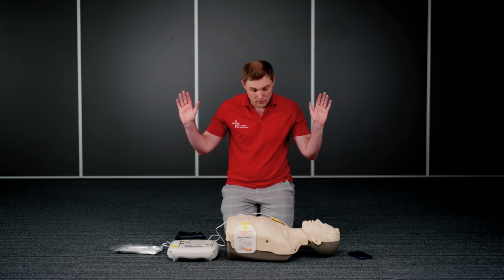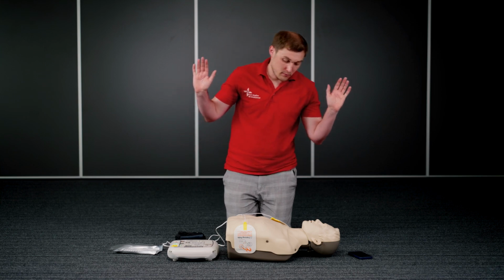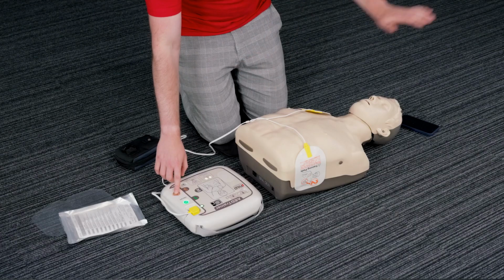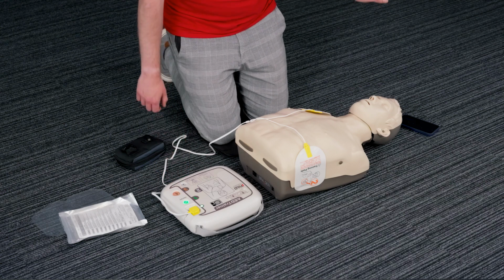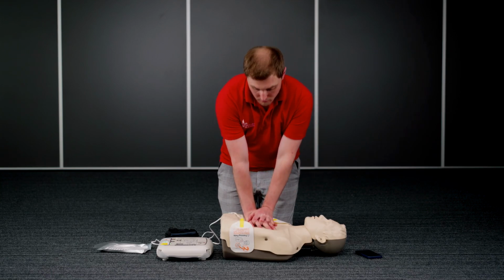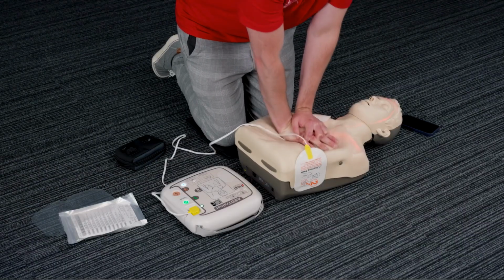Analysing heart rhythm. Shock advised. Stand clear. Press the flashing orange button now. Shock delivered. Begin CPR now. Press the flashing blue I button for CPR voice prompt.